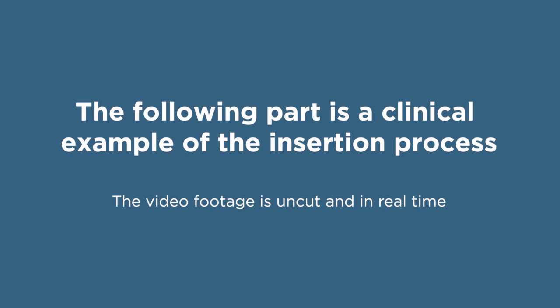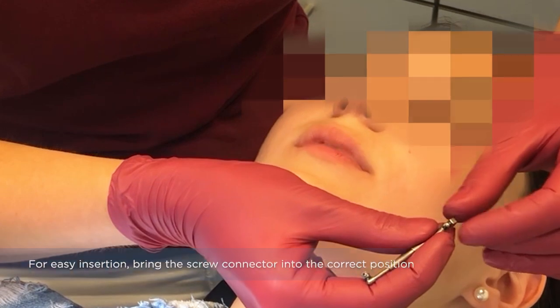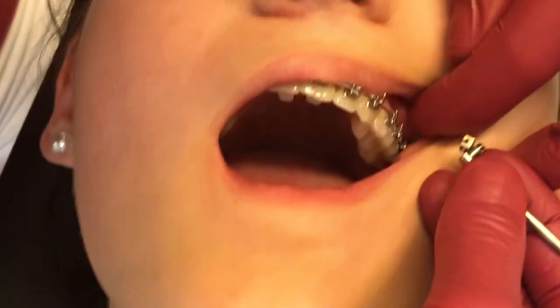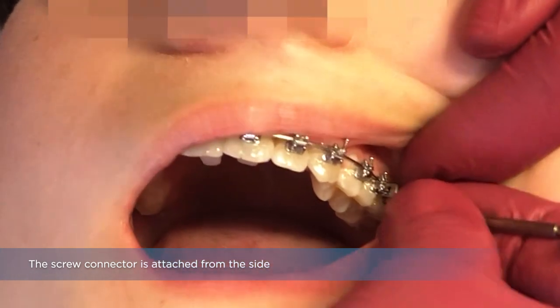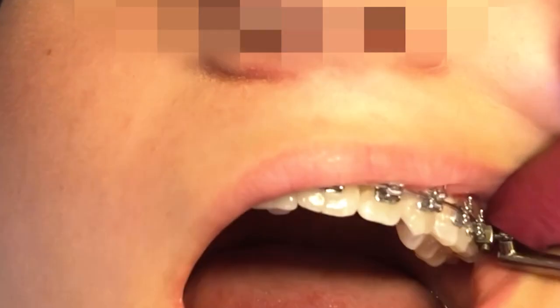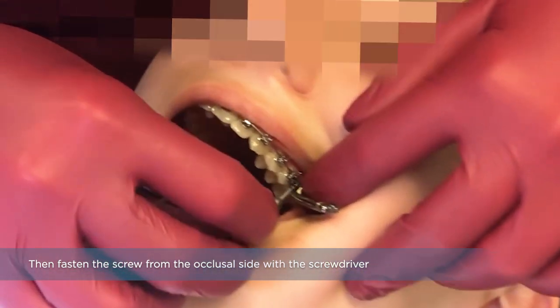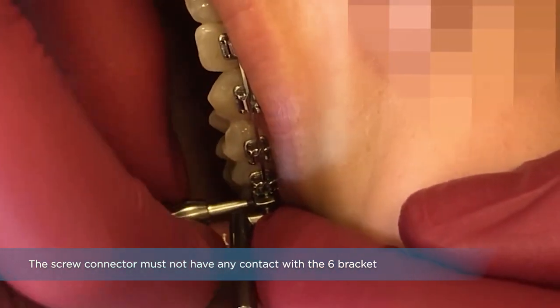The following part is a clinical example of the insertion process. We start with the installation on the upper jaw of the left side. For easy insertion, bring the screw connector into the correct position. The screw connector is attached from the side, then fastened from the occlusal side with the screwdriver. The screw connector must not have any contact with the 6-bracket.